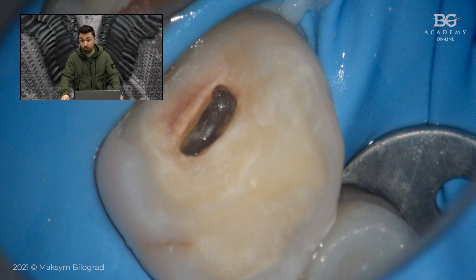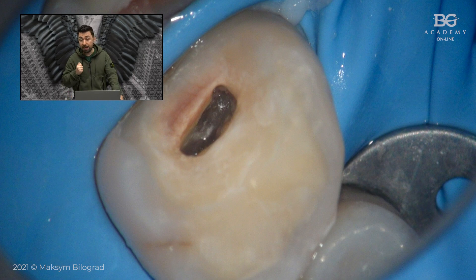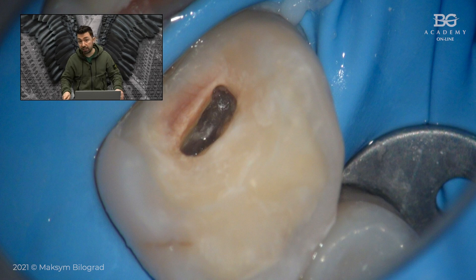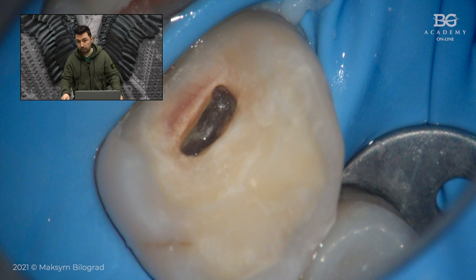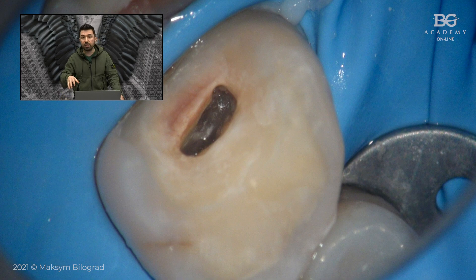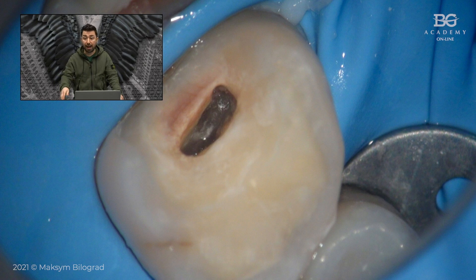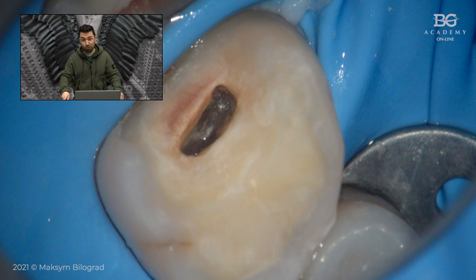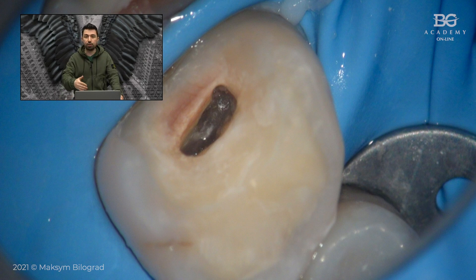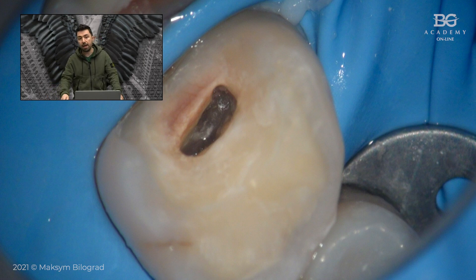The access looks pretty minimally invasive. I'm a big fan of common sense and not exaggerating clinical indications. We know we can do conservative access, but access has to be driven by the root canals we need to instrument. Endodontic treatment is not just about making a small access — it's about doing access, instrumentation, irrigation, obturation, and coronal restoration. Every single step has to be performed in a precise and optimal way.